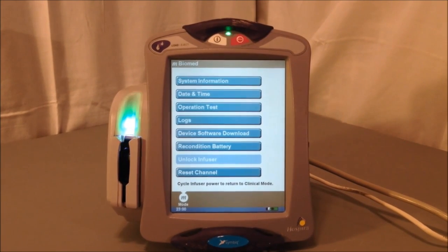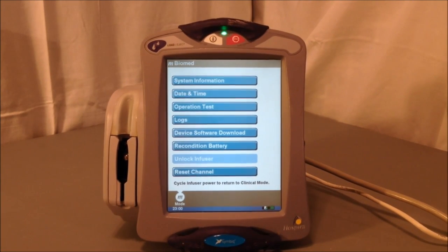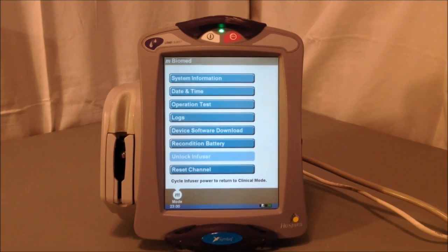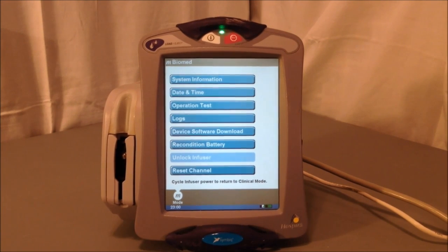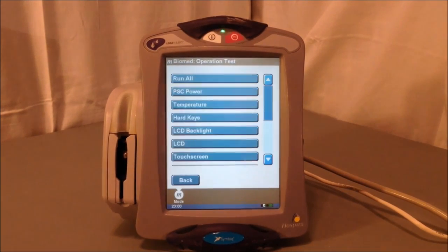But before we even got to this point, you could take a look at the three different architectures associated with these various pumps, and you could say, in all likelihood, the ones that are easiest to exploit had the fewest hoops to jump through from the connectivity engine to the actual pumping mechanism, right? And I think that's very important to understand.